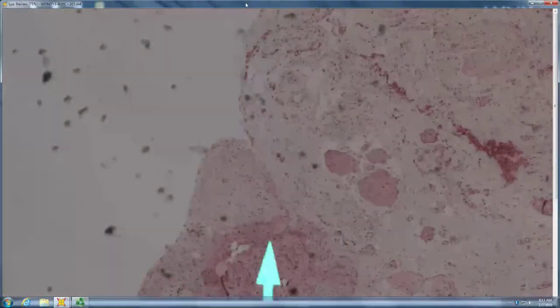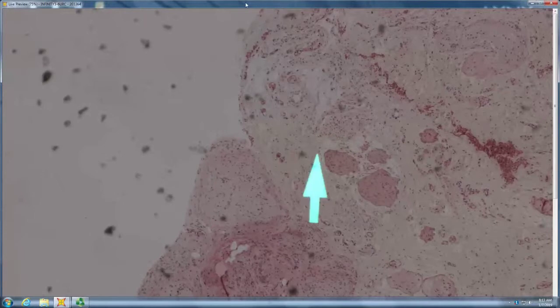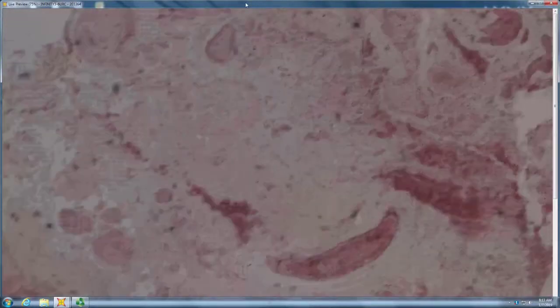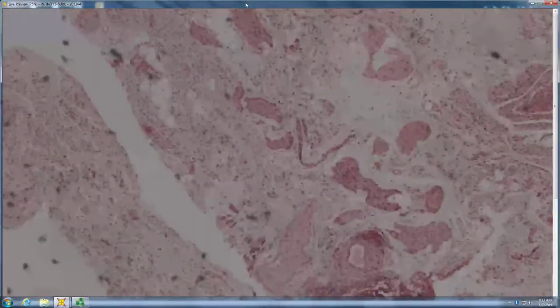Very deep. No attached skin. I think schwannoma was my first. So schwannoma is a single round to oval thing that's encapsulated. This has lots of individual things embedded in a myxoid stroma, like the last plexiform, like someone with von Recklinghausen's and plexiform neurofibroma. Correct.